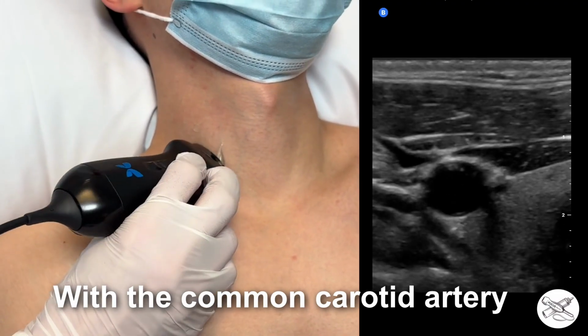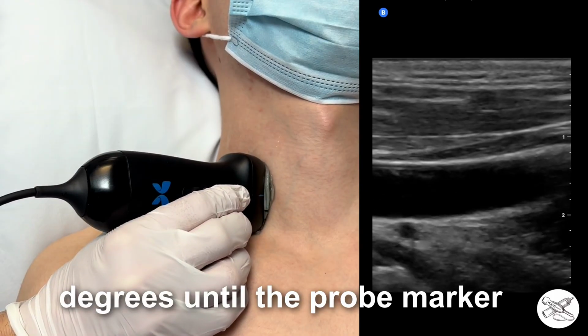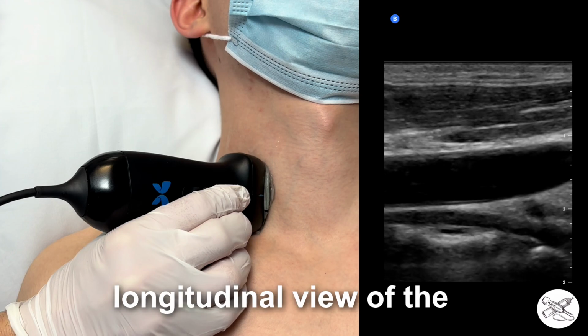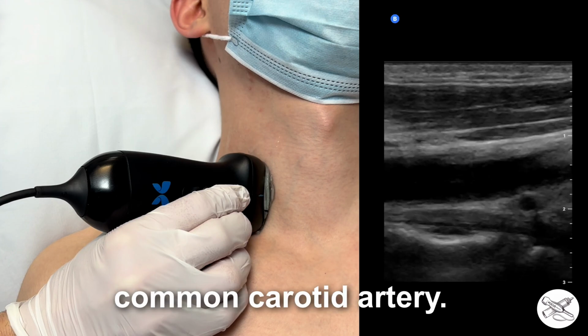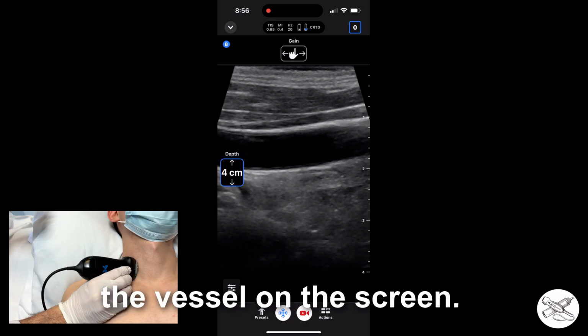With the common carotid artery centered on the screen, slowly rotate the probe 90 degrees until the probe marker is pointing toward the patient's head. You should now see the longitudinal view of the common carotid artery. Adjust the depth to center the vessel on the screen.